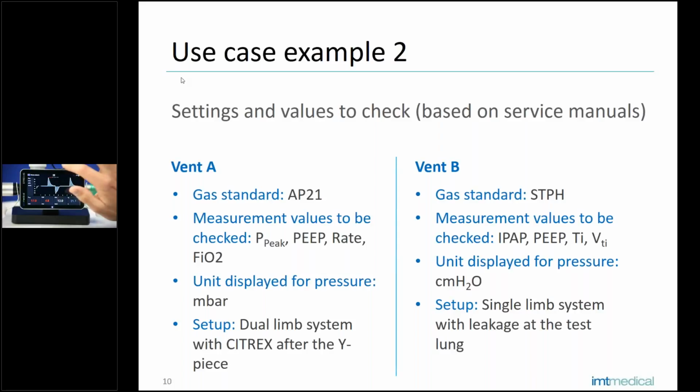And finally, also my trigger settings, I know them, I have already set them up correctly here in the trigger details to fit this measurement application. Here on my ventilator A, the trigger settings are based on my flow signal with a +3 liter rising edge start trigger and a -3 liter falling edge flow trigger for the stop condition.